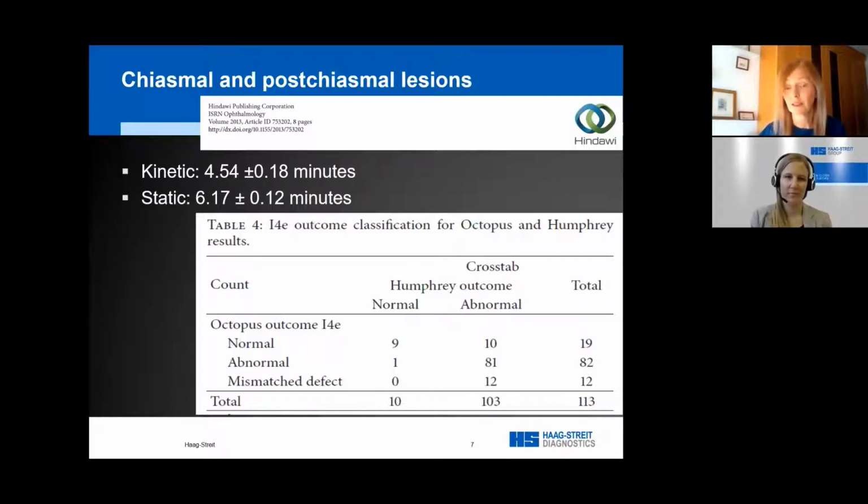Now, this is where we find kinetic perimetry invaluable, because you can slow the test, pause it, repeat the vectors, alter them, whatever you need to do. And that interaction with the patient helps to get a reliable field. But it doesn't have to be detailed in order to get enough information. So going back to a point earlier, if you only do a central field, you can miss peripheral defects or miss that the peripheral field is actually not badly affected. And it's very well documented that central fields don't predict the peripheral field or vice versa.